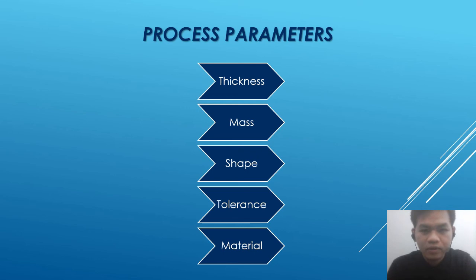The last point for this part is that the process chosen for the manufacturing of the new prosthesis must allow the material usage of the process. The material selected for this process is cobalt chromium alloy. So selective laser sintering could perform the manufacturing process on this material.